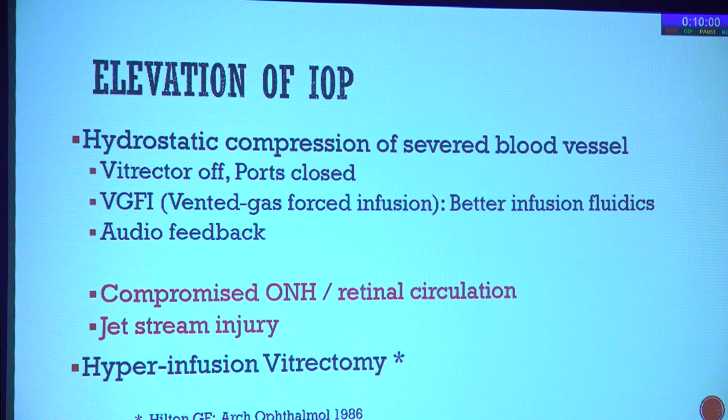And also think, if the cannulas are open, overused cannulas or non-valved cannulas, if there is a very high infusion pressure, it can create jet stream injury. Sometimes the retina is atrophic and you can have an iatrogenic break diagonally opposite to the infusion port.